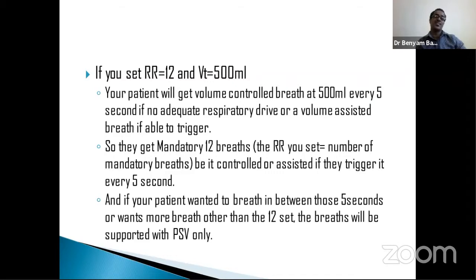a volume assisted breath will be added. If the patient does not initiate a breath, then you'll have 12 breaths per minute with a volume of 500 ml. And if the patient is able to trigger that breath, which is one of the set 12 breaths, he will be given the assist of 500 ml of volume or tidal volume. So they get a mandatory 12 breaths.